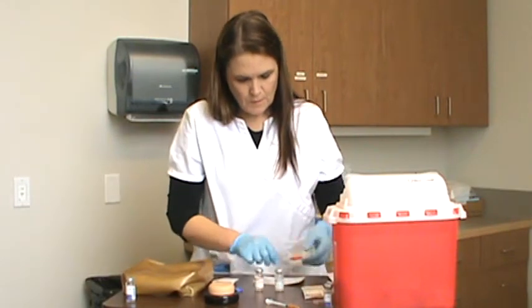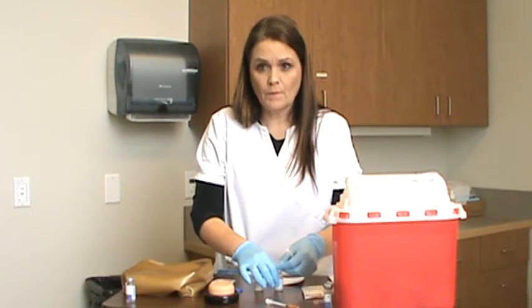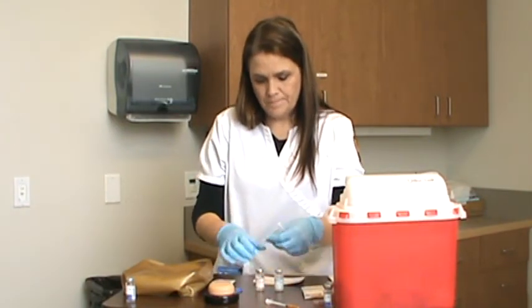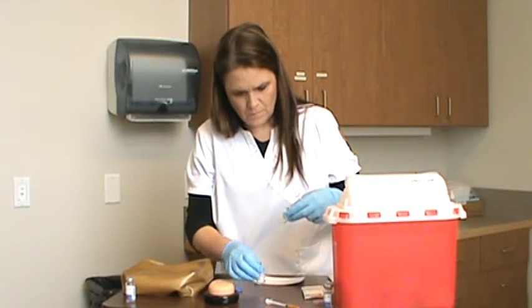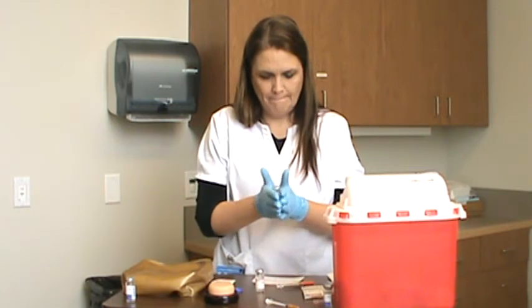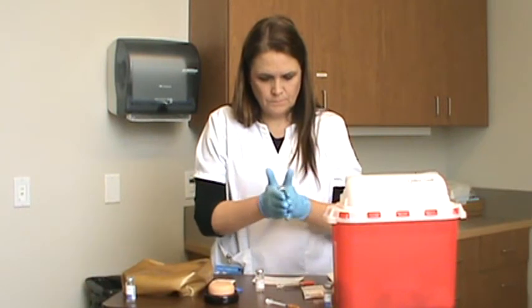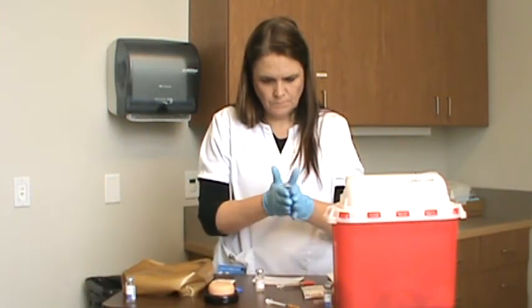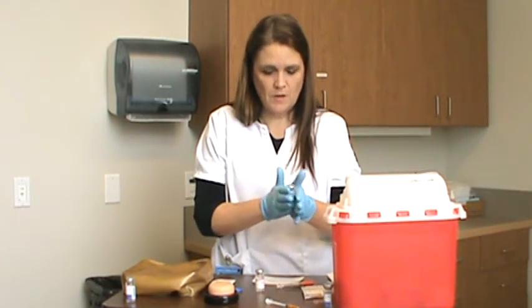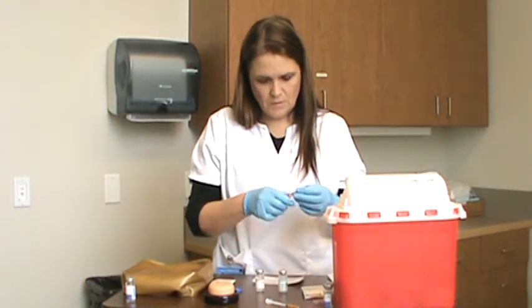So I would make sure that this is mixed up really well. And this you have to give pretty quick after you draw it up. You cannot mix the two together while you're drawing them up.